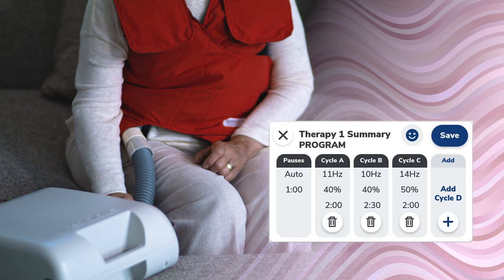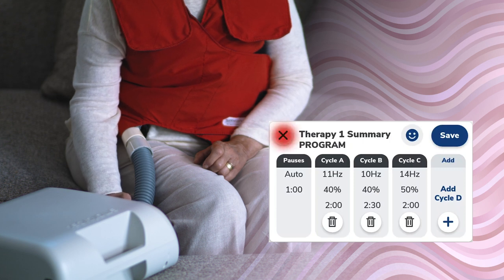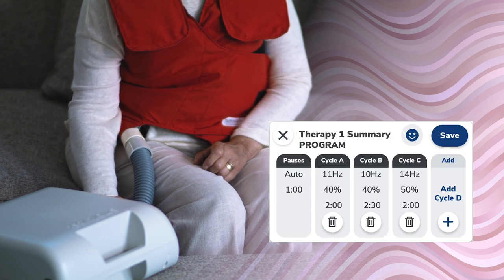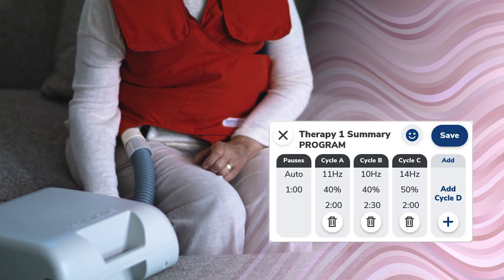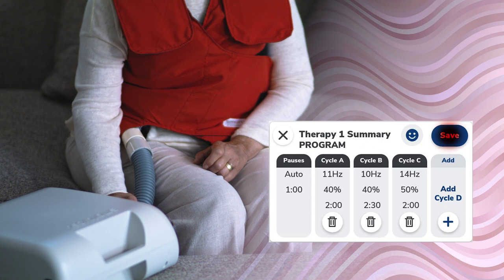To cancel the creation of the program therapy, tap the X in the top left corner of the screen, or tap Save in the top right to save the new therapy.